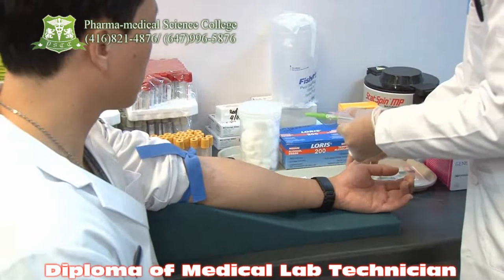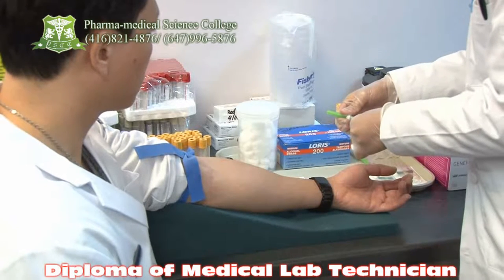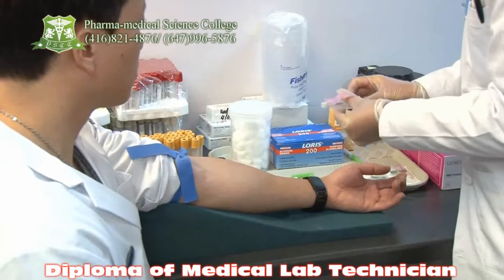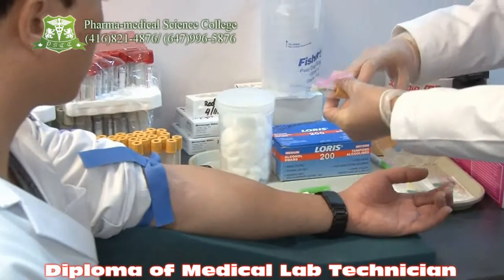We are going to use an SST tube. What is SST tube? Serum Separating Tube. Very good. Now take out the cover of the needle gently. Hold the tube. Very good. And now she is going to do the act of phlebotomy.